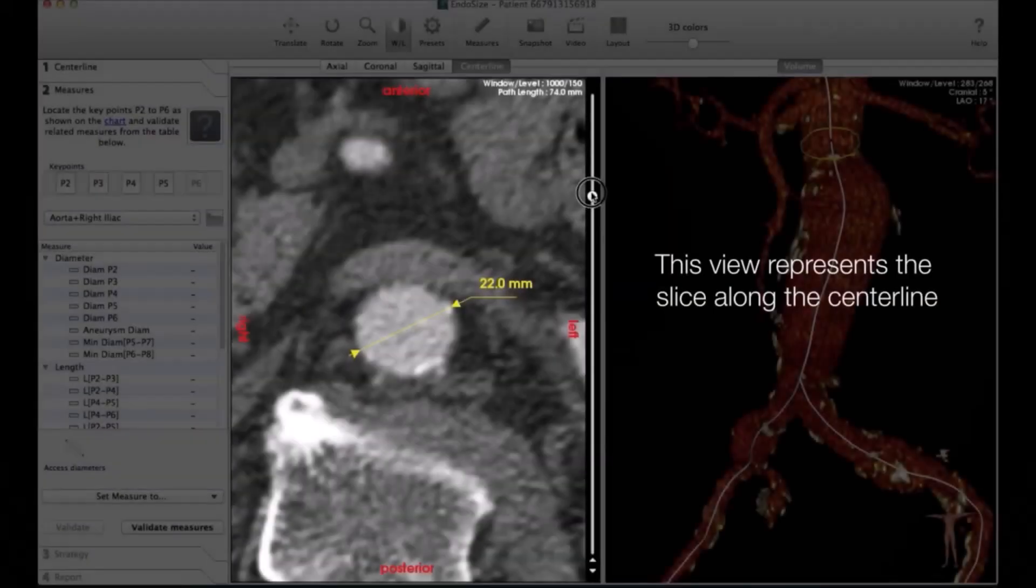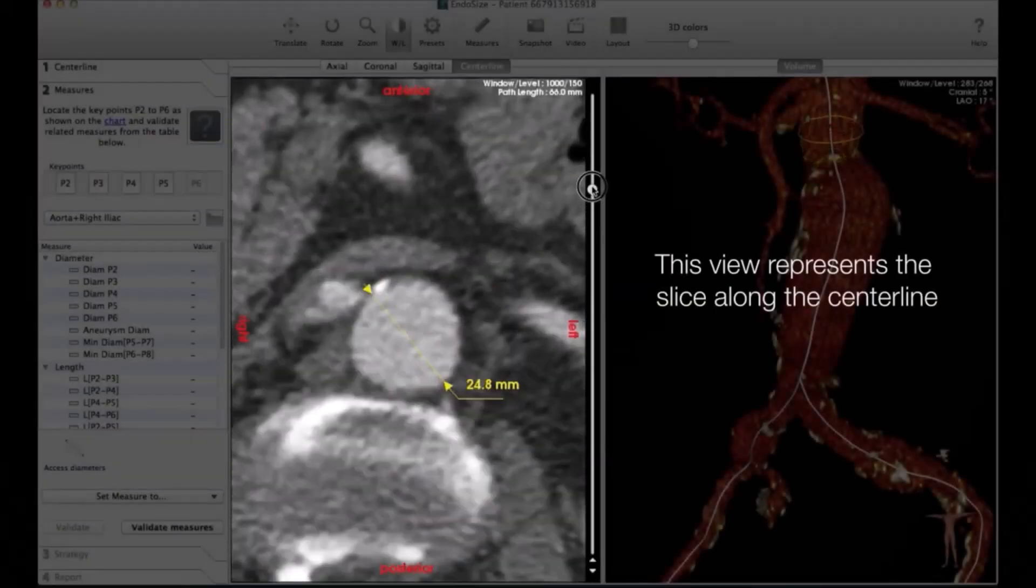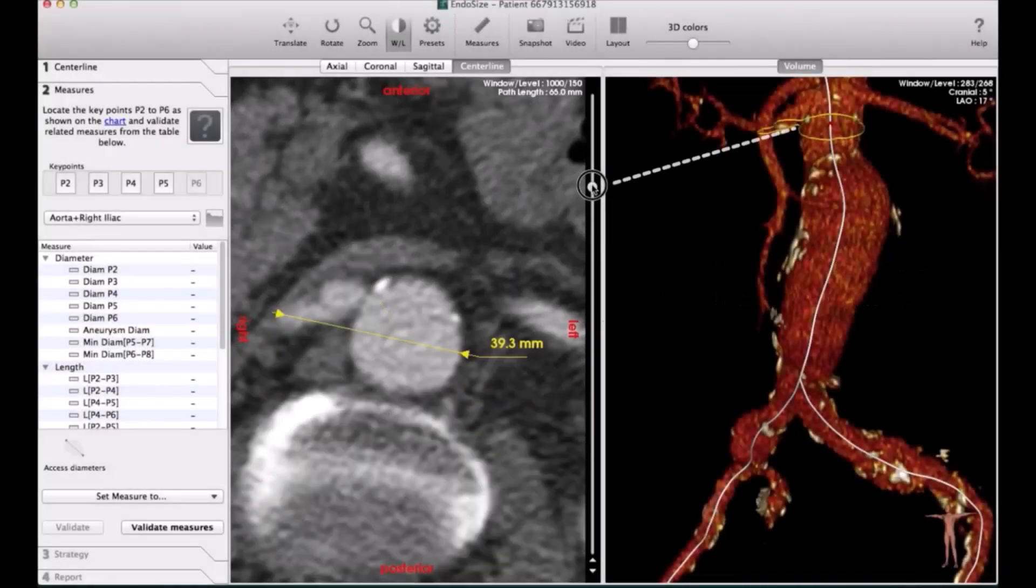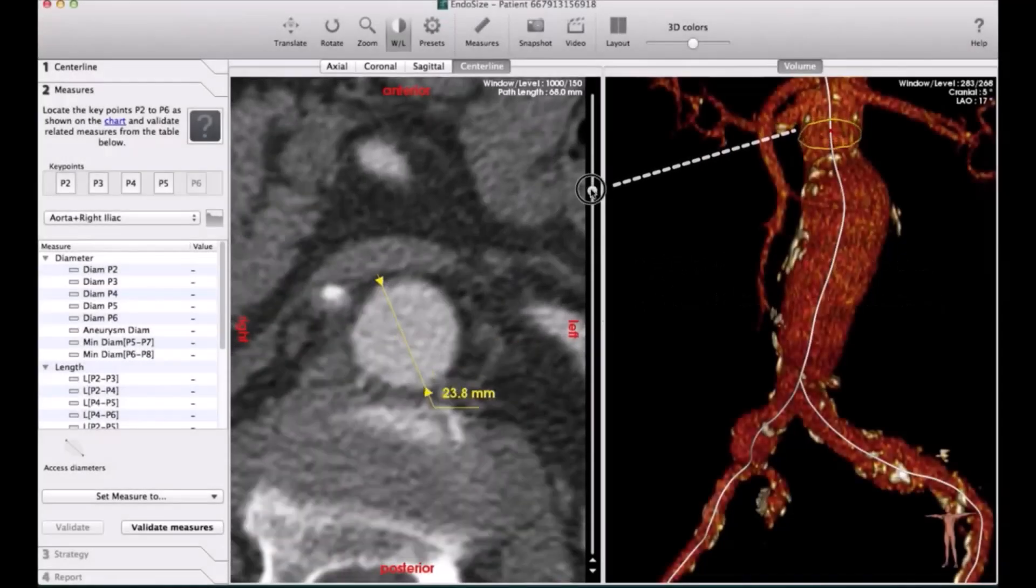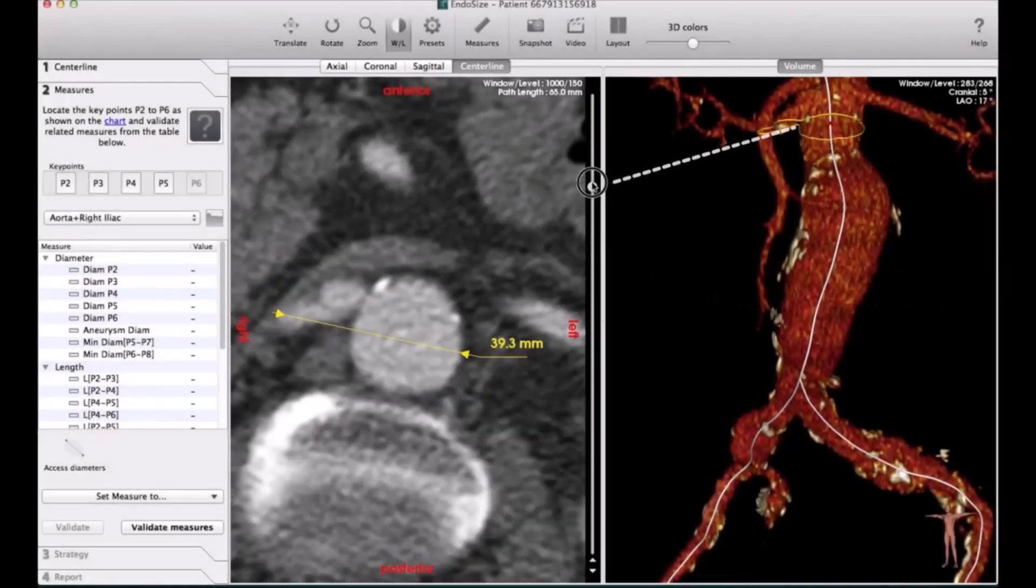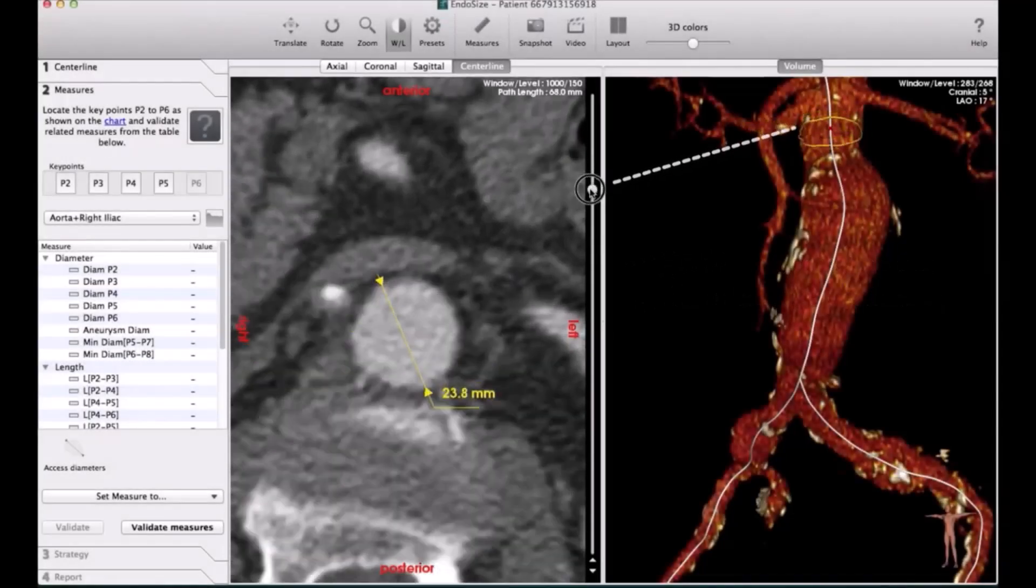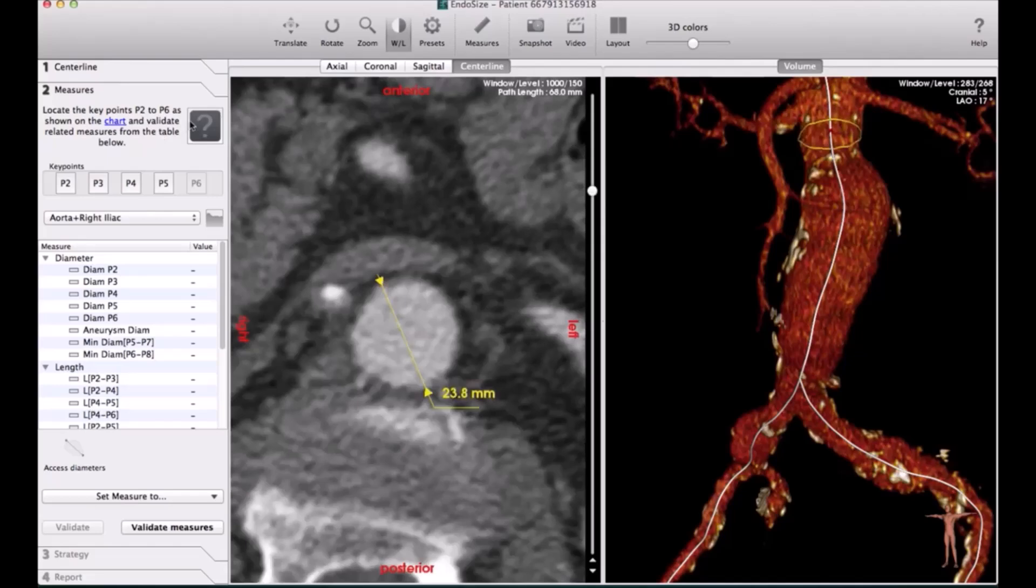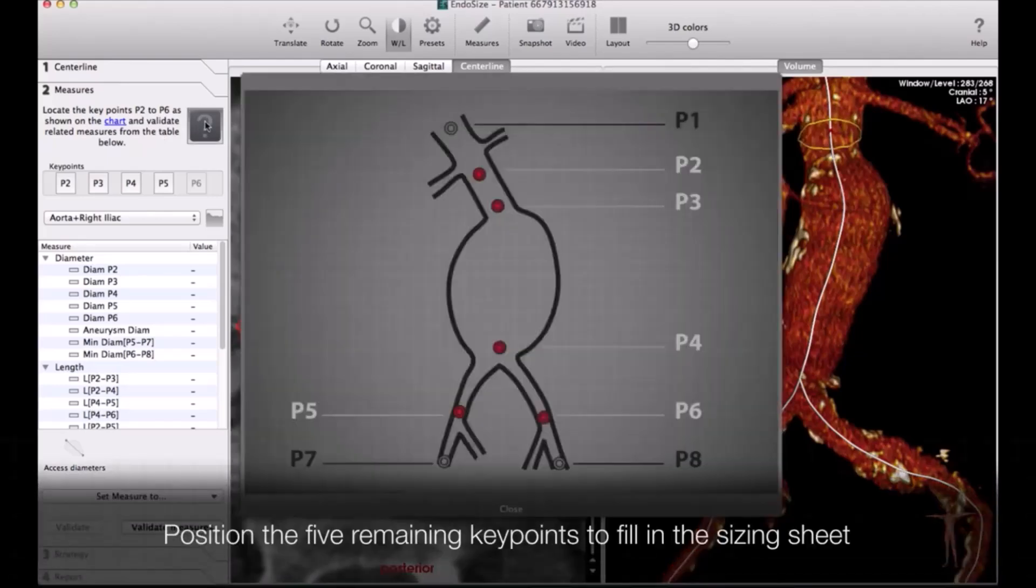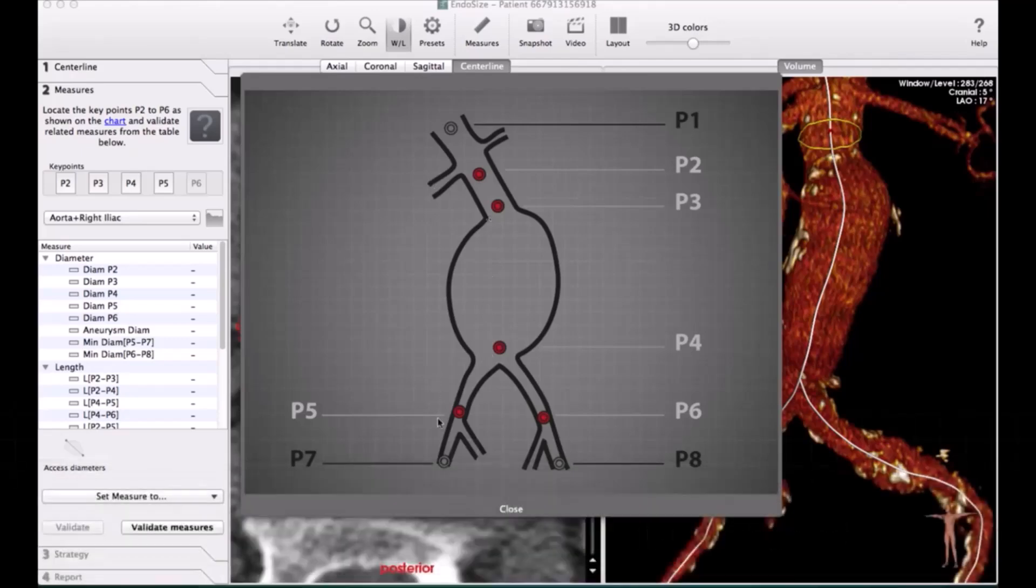You can also assist the measurements, so if you don't like the measurements that have been done, or you have maybe more transverse diameter at the neck, you can do the measurement yourself and then you can put it into the software.